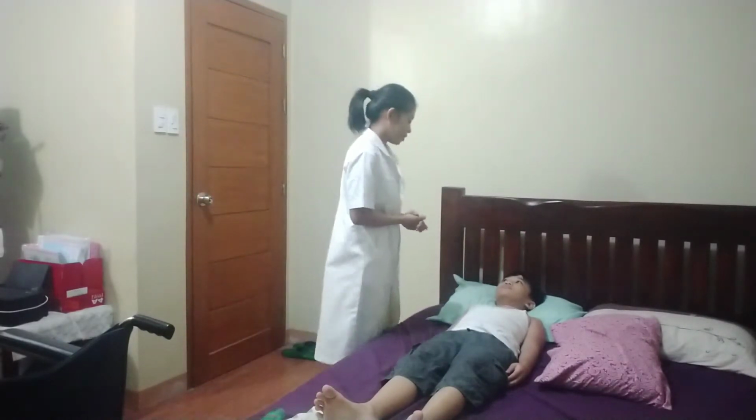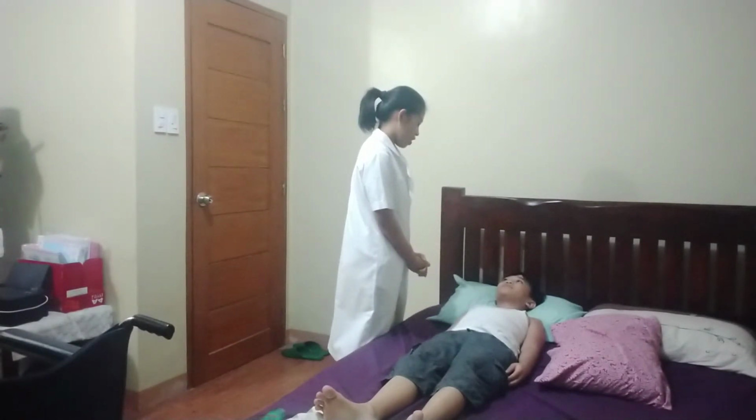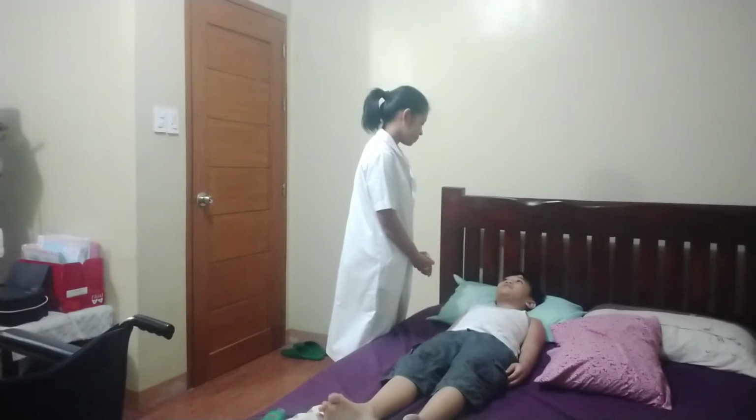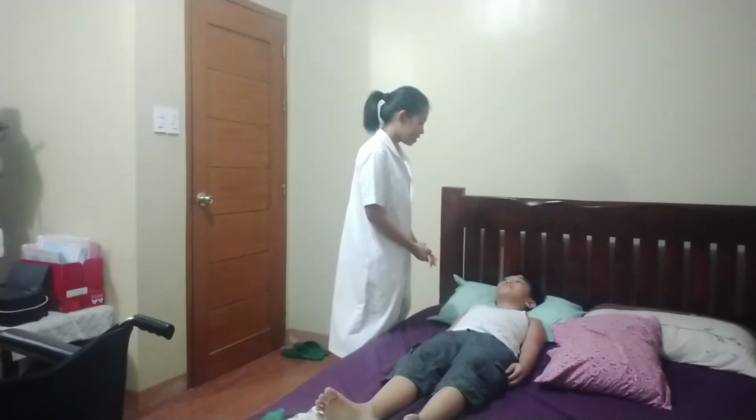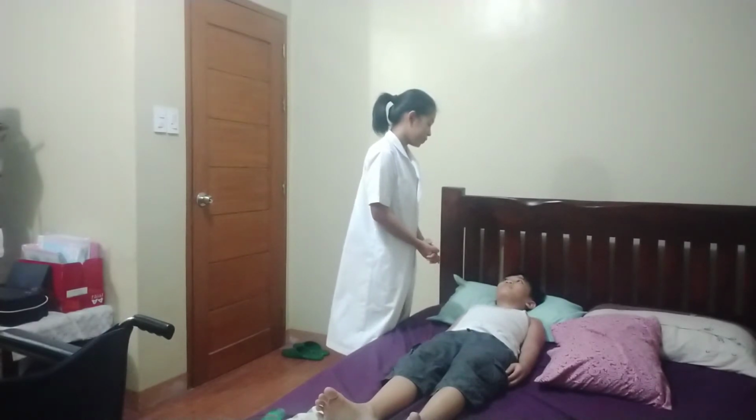Good day, sir. I'm Cheryl Po, your nurse for today. May I know your name? Okay, how old are you na po? Okay, for today po, I will be transferring you po from your bed to a wheelchair po, sir. Would that be okay for you?